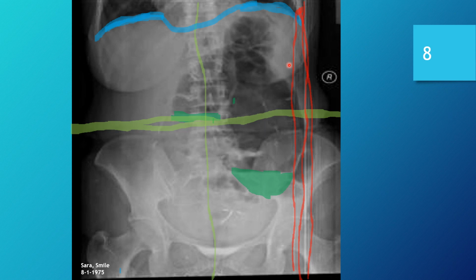Even if we didn't want to make adjustments for the diaphragm, this initiates a repeat process immediately, as this is not acceptable for a diagnostic image. So one of those things to remember and keep up with.